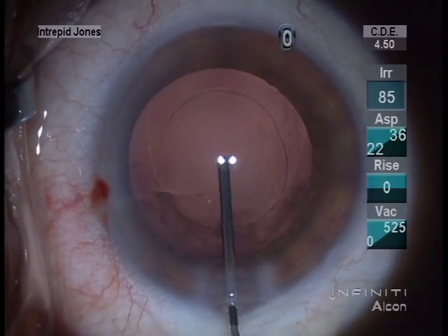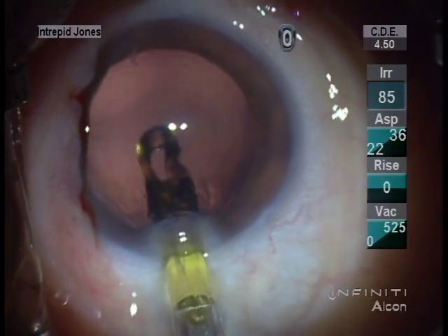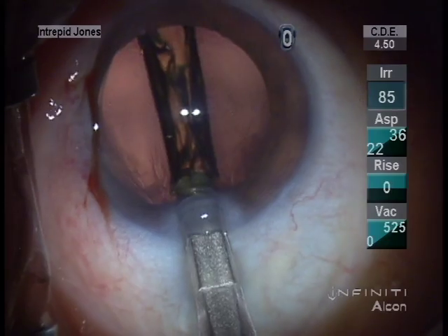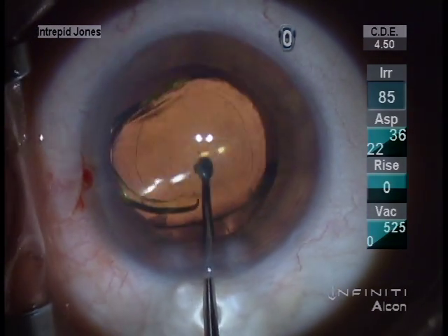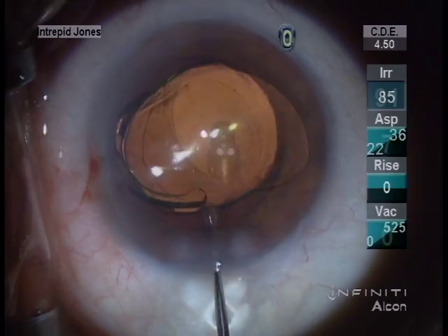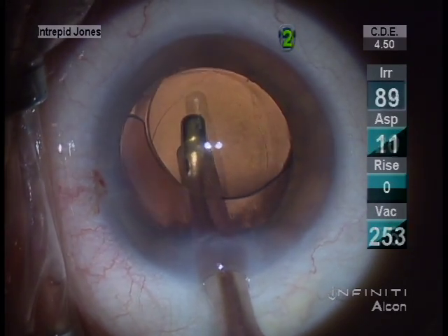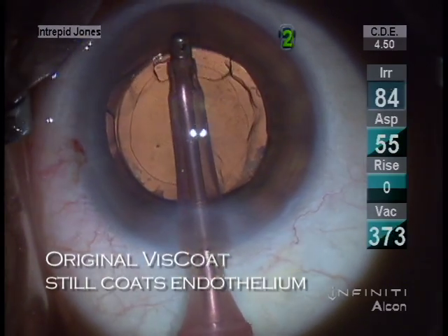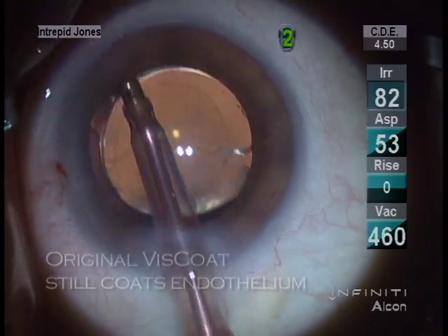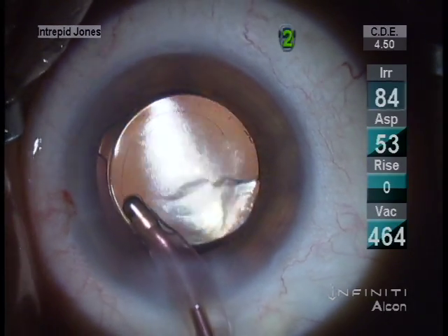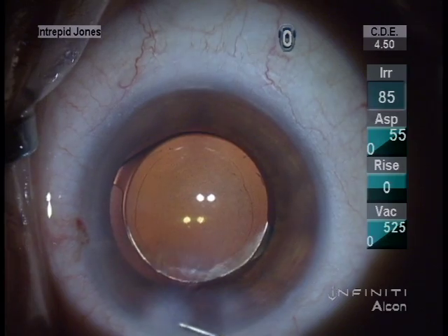These are removed with IA. The lens is then placed through an unenlarged 2.2 mm incision. All viscoelastic is removed from the capsular bag as well as from the endothelium, and we can see here we have the original Viscoat protection throughout the entire case.